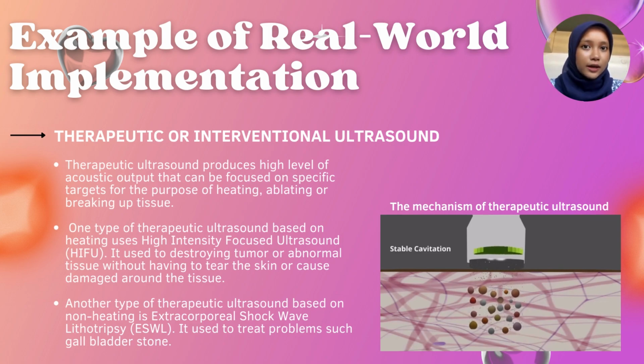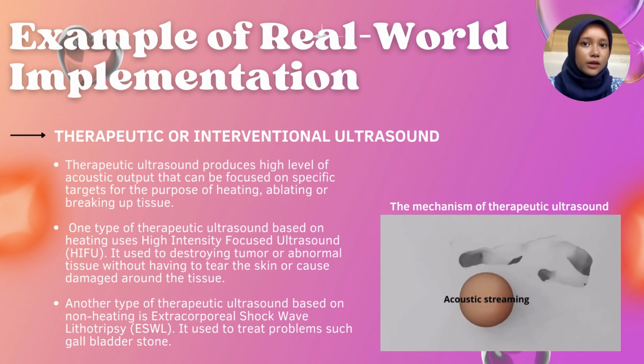Another type of therapeutic ultrasound that is based on non-heating is extracorporeal shockwave lithotripsy, or ESWL. It is used to treat problems such as gallbladder stones. Fluoroscopy is used to target the acoustic focus on the stone.